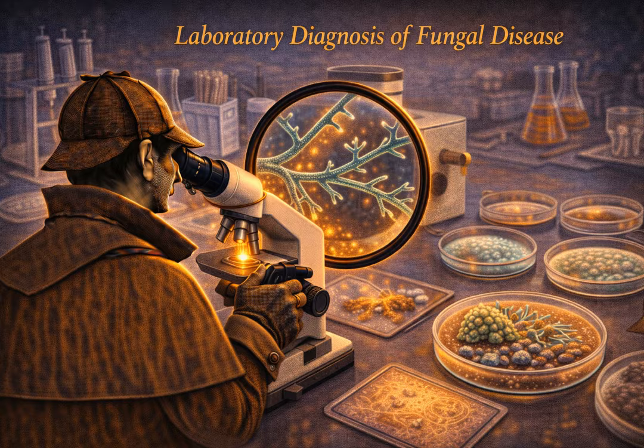But there is one cool piece of tech Marie mentions here at the end. T2 Candida. This is genuinely fascinating. It uses T2 magnetic resonance, essentially miniaturized MRI technology. It detects Candida cells directly inside a whole blood sample. You do not need to culture them or extract them first. No culture at all. No culture. It takes 3 to 5 hours, not 2 to 5 days. It's extremely fast and can detect incredibly low numbers of yeast cells, down to 1 to 3 colony-forming units per milliliter of blood.